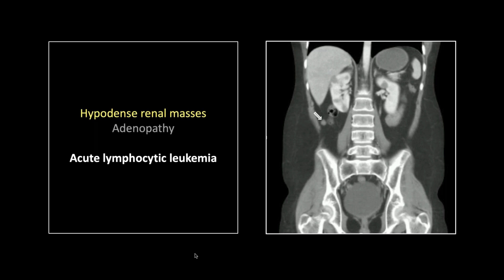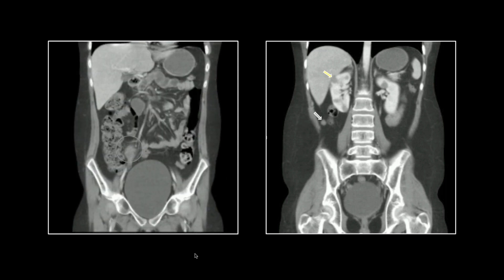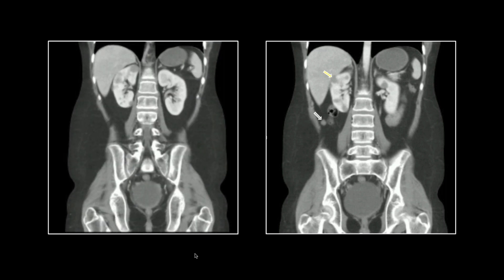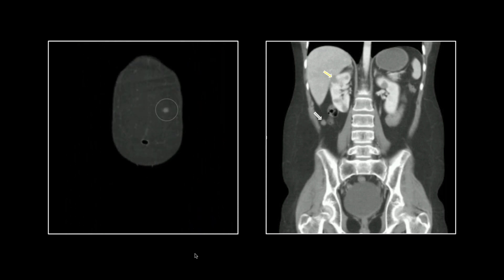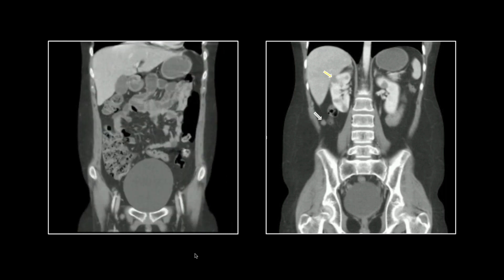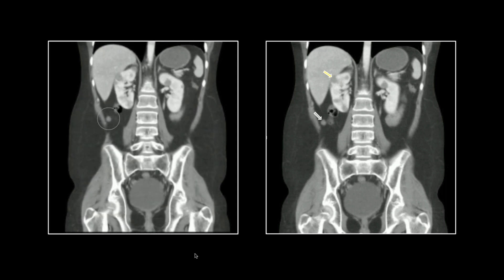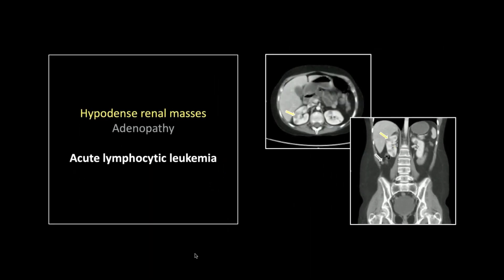On the coronals, again: hypodense masses in the kidneys, that retroperitoneal node, the subcutaneous one, and the iliac node. The renal masses — hypodense, rounded, bilateral — are pretty classic for lymphoma. So that is acute lymphocytic leukemia manifesting as do most lymphomas.